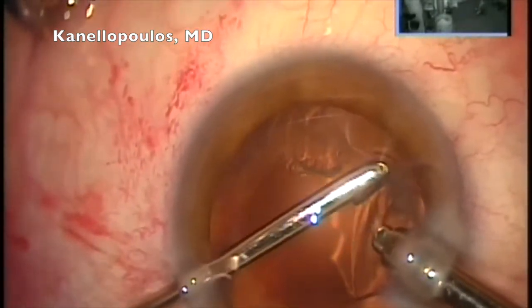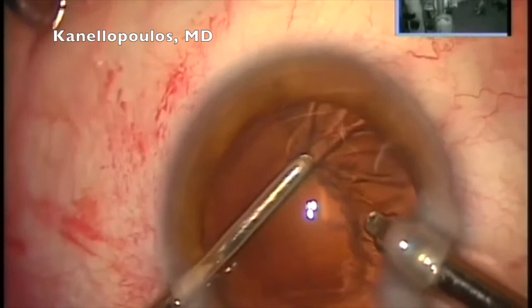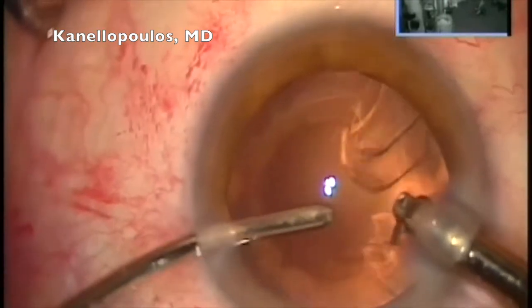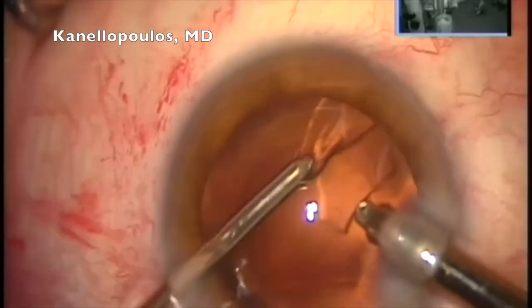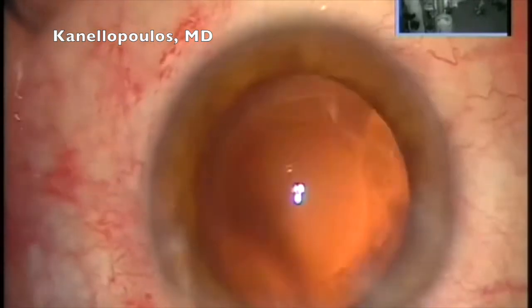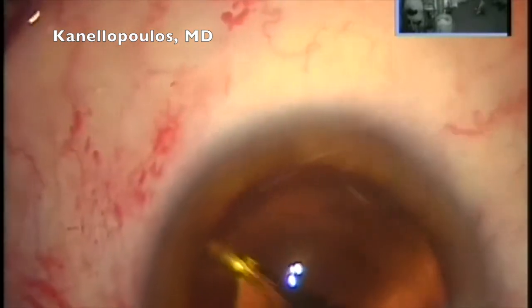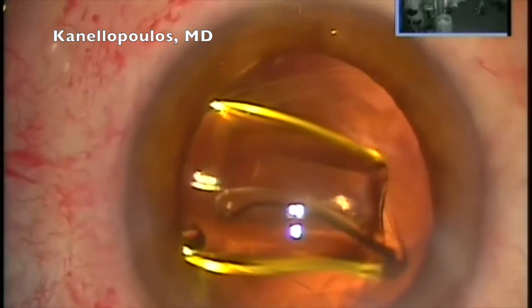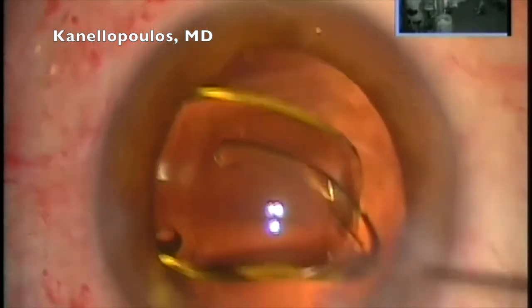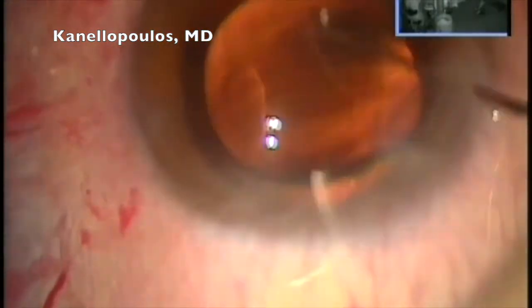Now carefully removing the cortex — we see no problems in the capsule bag. The capsulorhexis is still nice and central. I'm using my split aspiration instrument through my paracentesis, keeping my irrigation main tool and the main incision with a very stable anterior chamber and capsule bag. A 5.0–5.2 mm capsulorhexis. Everything looks perfect. Quite a large lens — slightly hyperopic eye. Non-toric. We're going to carefully implant the lens once we've filled the capsule bag with viscoelastic. This is the most interesting part I want to share with you. This is my routine manipulation — I'm going to let the beautiful Microseal material unfold, always very elegant. And here I'm going to orient the lens horizontally.